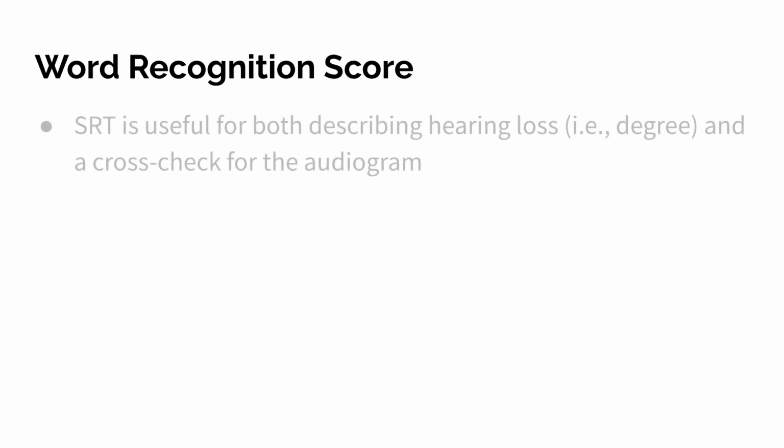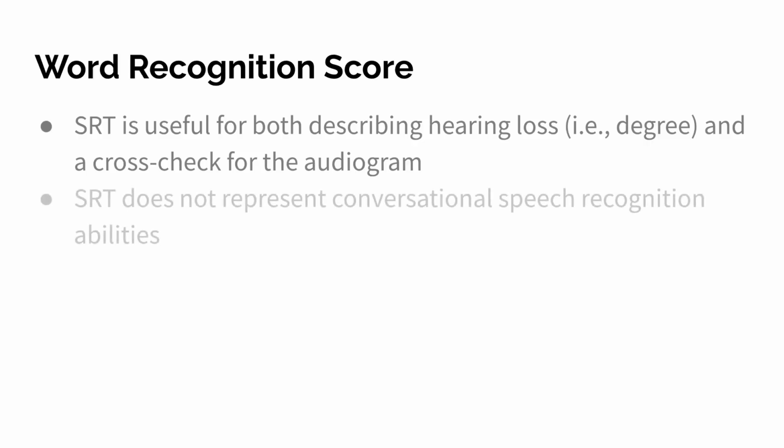Now moving on to word recognition score. The SRT is useful for both describing hearing loss, degree of hearing loss, and as a cross-check for the audiogram, but the SRT does not represent conversational speech recognition abilities, nor does it represent maximal speech recognition abilities.